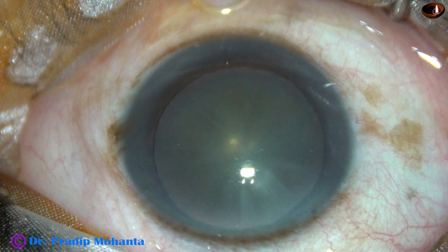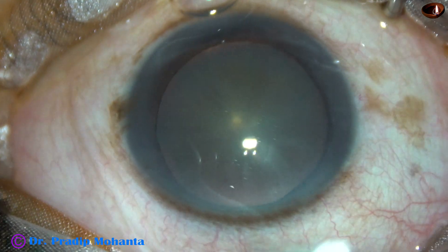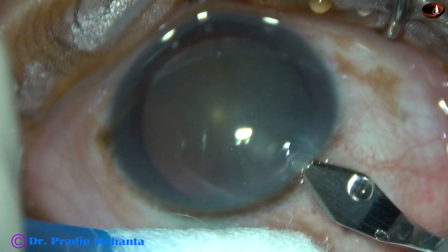In this video I am going to show my lens tilt technique. This technique is used for very soft cataracts like this one. Let us observe the full surgery.